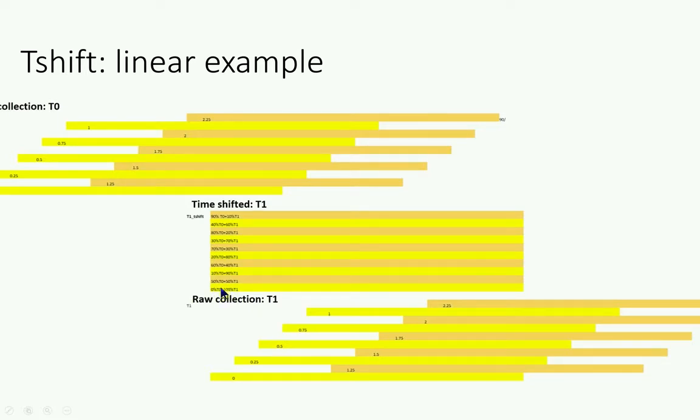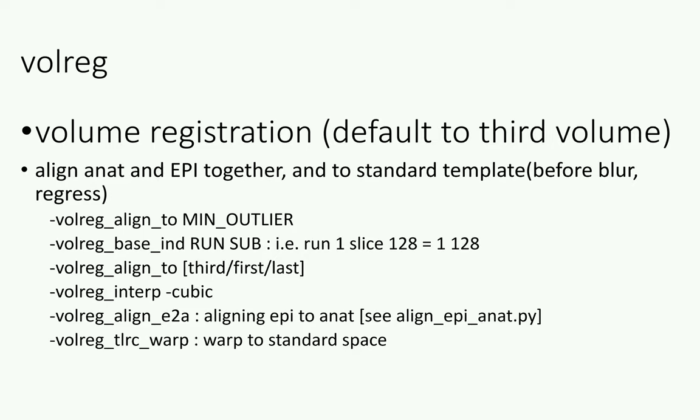The way in which you'll be doing this is actually spreading out over a broader period of time to get a more accurate interpolation of that data point, because you will never actually collect your data all at once at that time point. As the TR, like Miriam said, as the TRs increase, you will get closer to collecting more of the brain in a smaller window of time, and the concerns maybe will reduce in that regard.